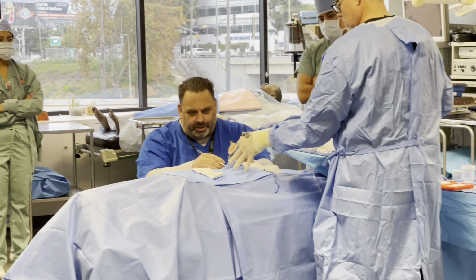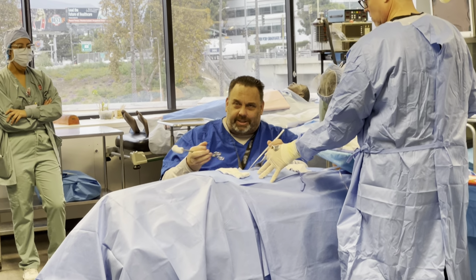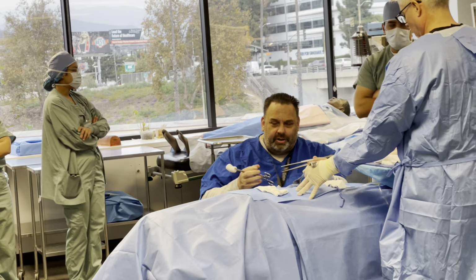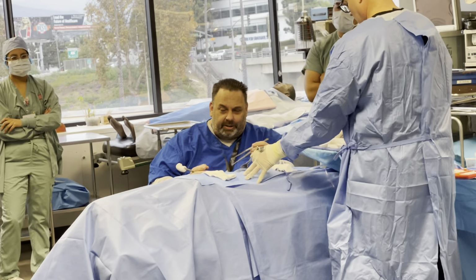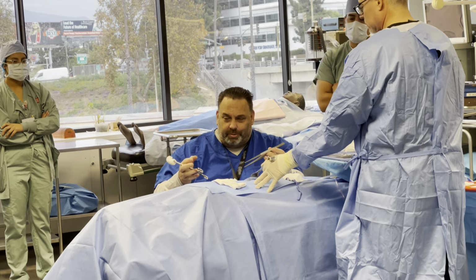So pretty much we're just gonna watch how you guys pass instrumentation. We're gonna teach you that in a week or two: how to pass things, how to load blades, how to do sutures. So that's what I'm looking for in this mock. Look at how you drape out and how you perform up here, okay? It's not a big surgery. We really just mock surgery. At the end of the surgery though, we're going to close the abdominal cavity. Get your suture, please.